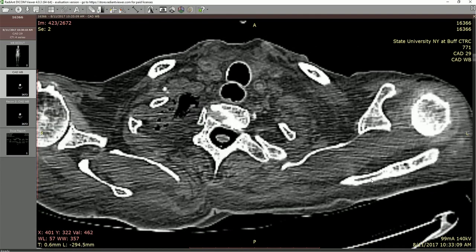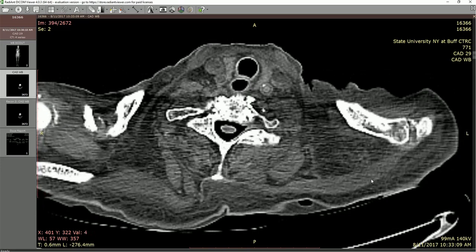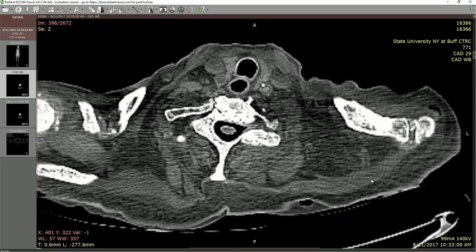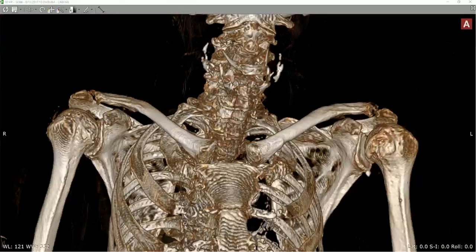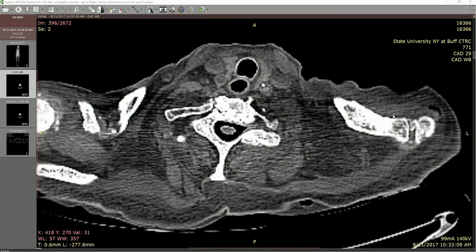Something quickly to show on the other side: when you look at the left acromioclavicular joint, there seems to be more deterioration, which shows up on the CT where we have a bit more of a gap than what we saw on the previous image. We can see the erector spinae and transversospinalis group here, and the clear outline of what would be the trapezius muscle on this side as well.